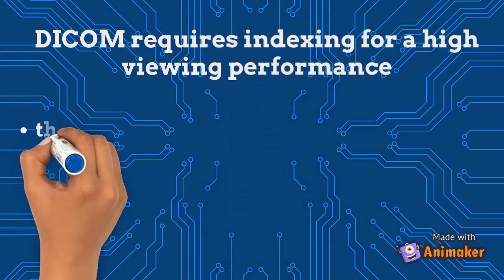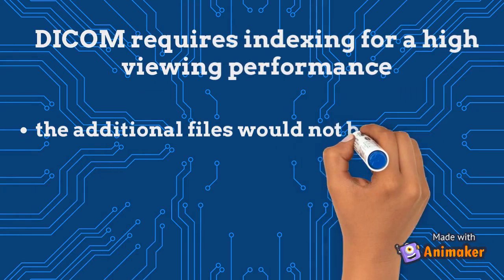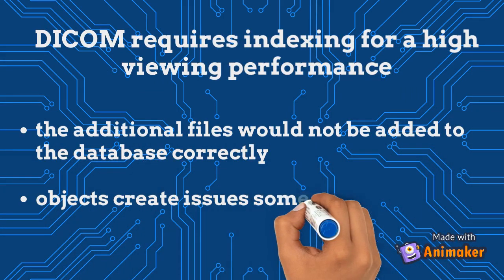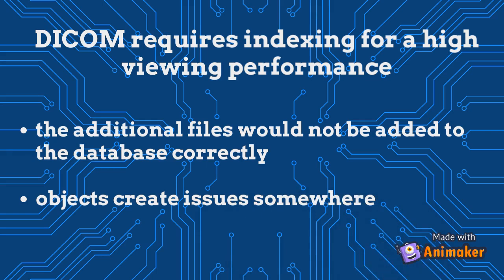Other than that, DICOM requires indexing for high viewing performance. Without a correct indexing process, the additional files would not be added to the database correctly, which will cause the objects to create issues somewhere.